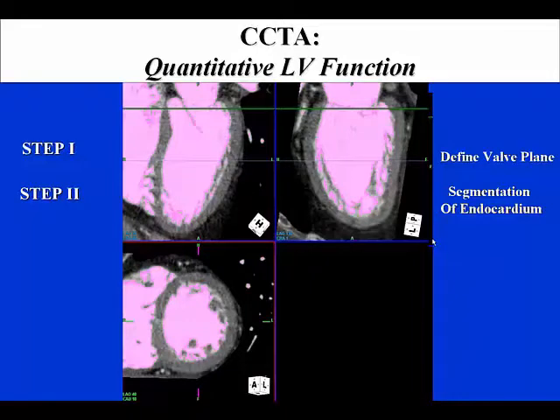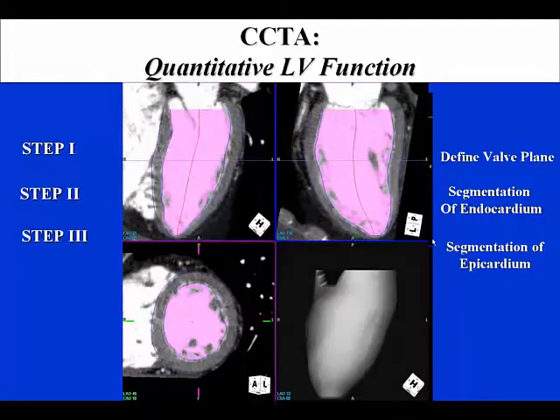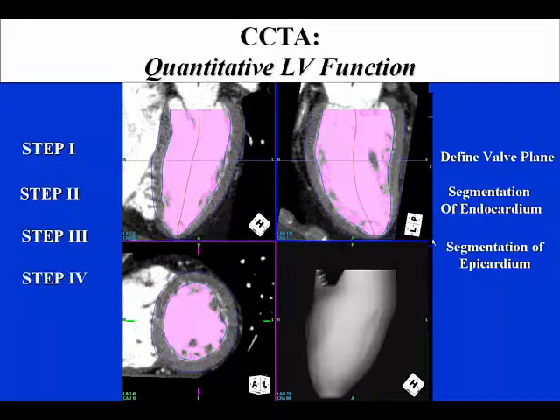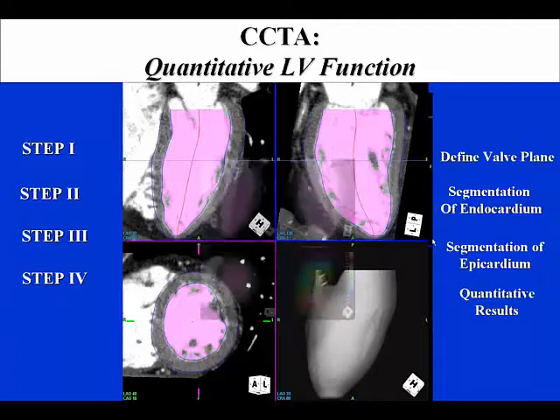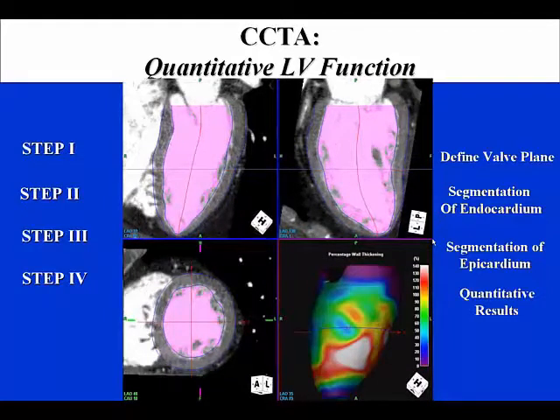Step 3 involves segmentation of the epicardial surfaces, as demonstrated here. Once the epicardial surfaces are demonstrated, one has the ability to look at quantitative information about the entire left ventricle. In Step 4, you can have quantitative results, which are demonstrated here, including in the lower right-hand panel a schematic illustration of cardiac function in a volumetric-type display.